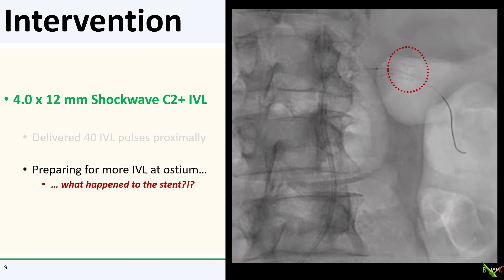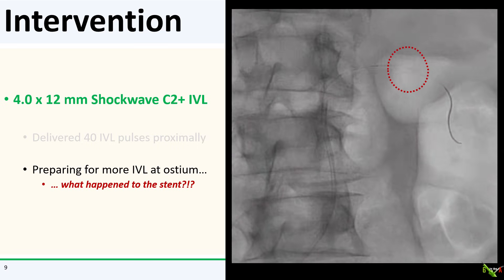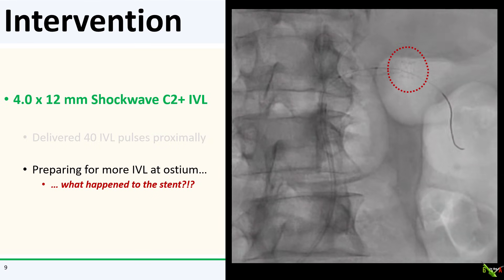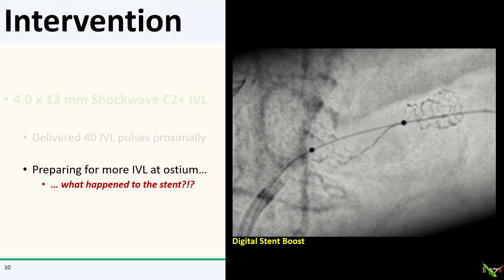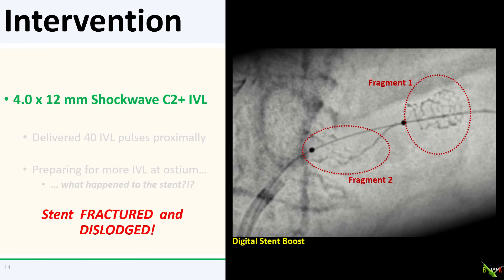The shockwave IVL balloon looked to be in a good spot, but look at the stent distally — it looks a little funny. It seems a little short and a little bit more distal than where it was deployed. What happened? It seems that the 5.0 by 12-millimeter stent fractured during shockwave intravascular lithotripsy, and the distal stent fragment became dislodged and partially embolized down the renal artery.